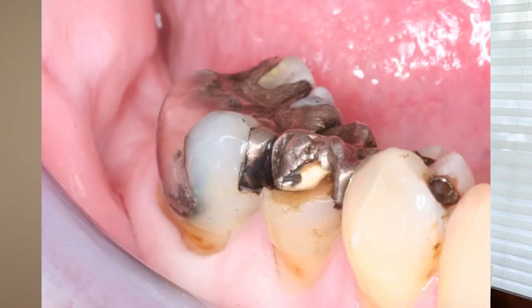Hi dental fans! Ever wonder how dentists get close-up photos of teeth and smiles?